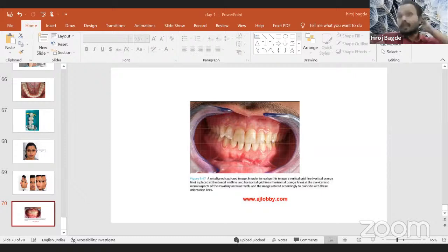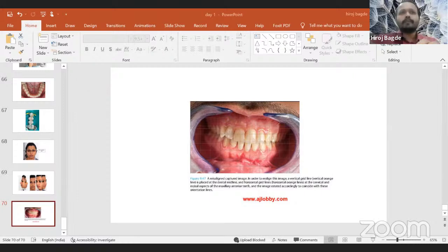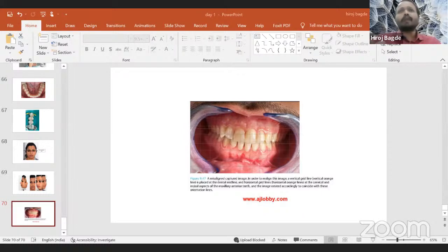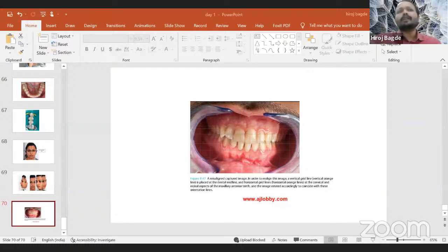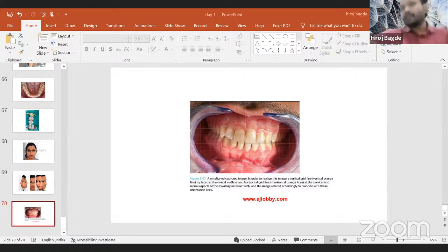Procedure-wise, we are looking at an image with not that much of a cant, so we are going to go directly. There are image options here — you can see crop, straighten, red-eye, auto-contrast, auto-color, retouch, text, fill light. What we are going to check first is something called a histogram. Can you see the histogram over here? This is the histogram of the camera, mentioning the color system, luminosity, and white balance inside the image.